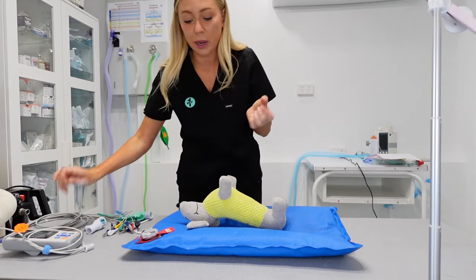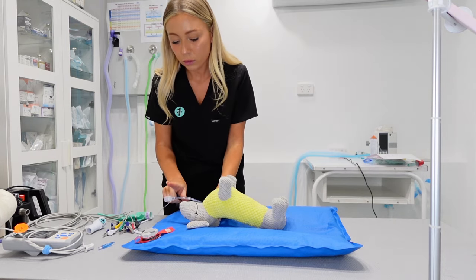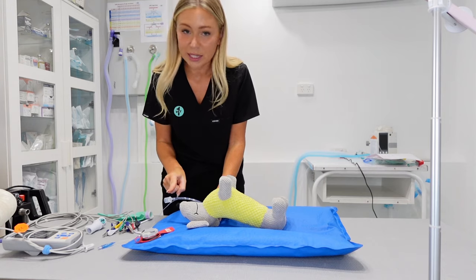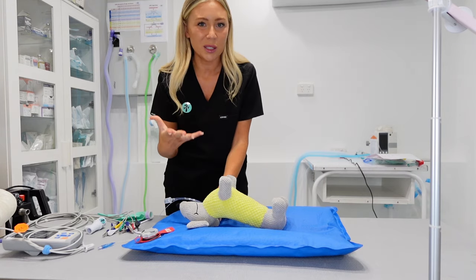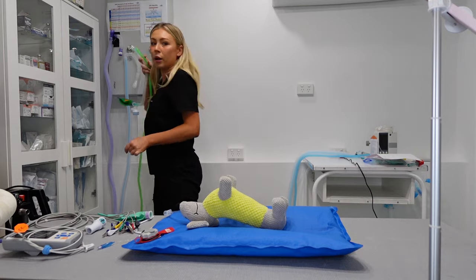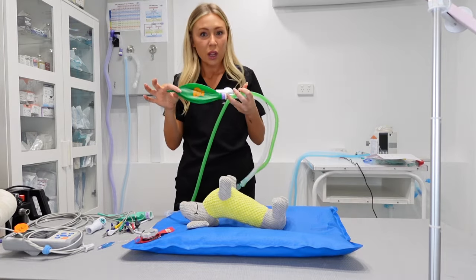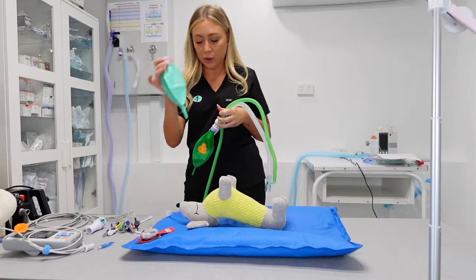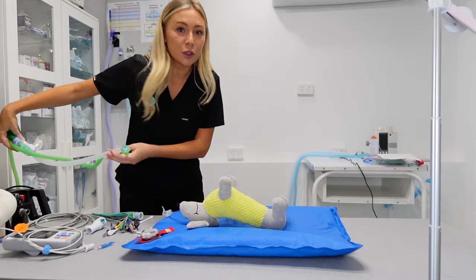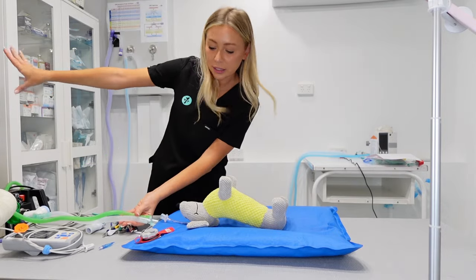As soon as your patient is intubated — we've got a tube in here — I'm going to turn on the oxygen and attach my tube. This patient is tiny so I would just want a tiny tee piece. Breathing set — say this is attached — I've got a small half-litre bag on here. Definitely do your measurements for your bags first before shaving. So this is all connected.